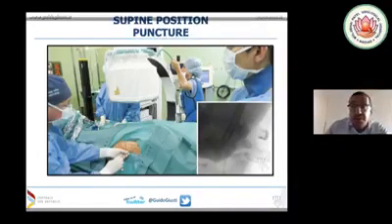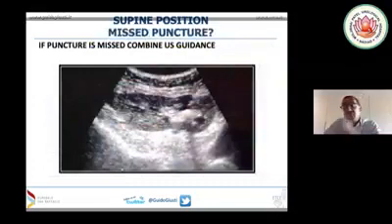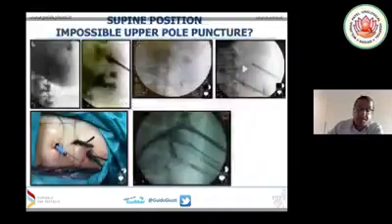So remember, it is the opposite. If it is below during tilting, our puncture is too anterior. Vice versa, if it is above, it is too posterior, like it was in prone, honestly. Then, of course, even though I am not a good user, another solution is to use ultrasound. Ultrasound can overcome all these limitations because you can very easily detect the depth of your puncture. And of course, you can also detect organs that lie in between the skin and the kidney.